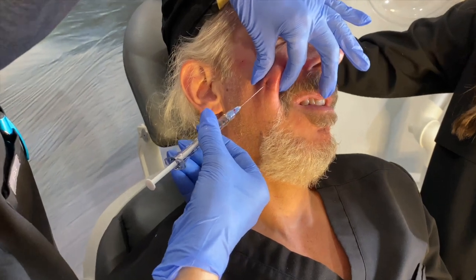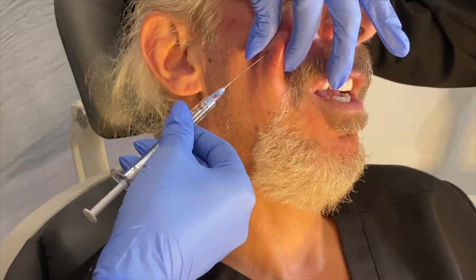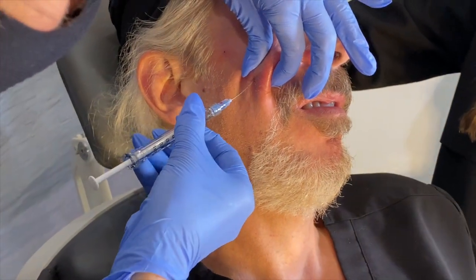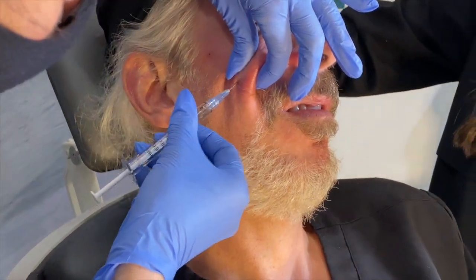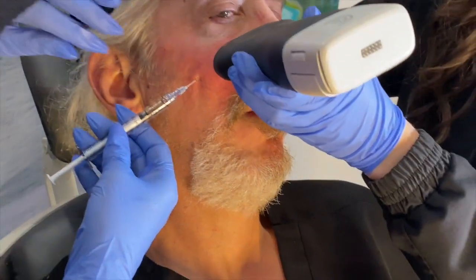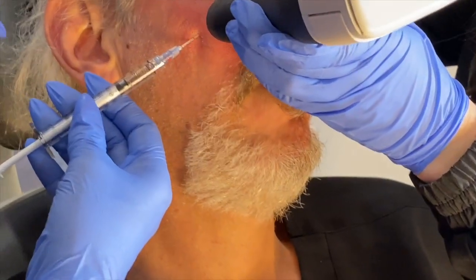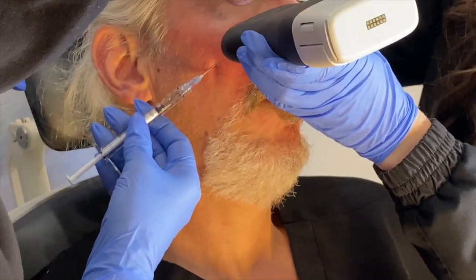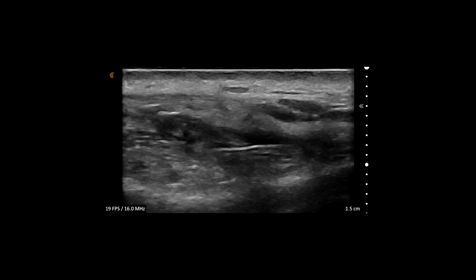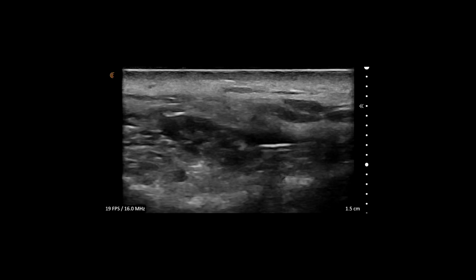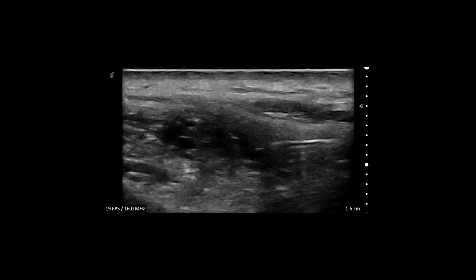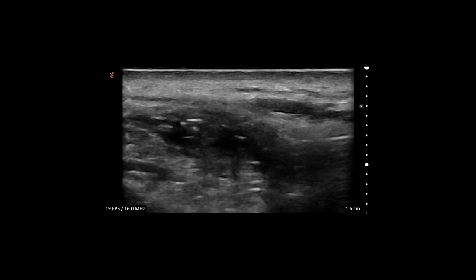This injection is in the prezygomatic space and you see the cannula popping through the SMAS twice, and you enter that prezygomatic space. The injections are going to occur into that space and into the area where the medial SUF is. Here you can see that the cannula is placed deep to the SMAS and injecting in that prezygomatic space and medial SUF area.